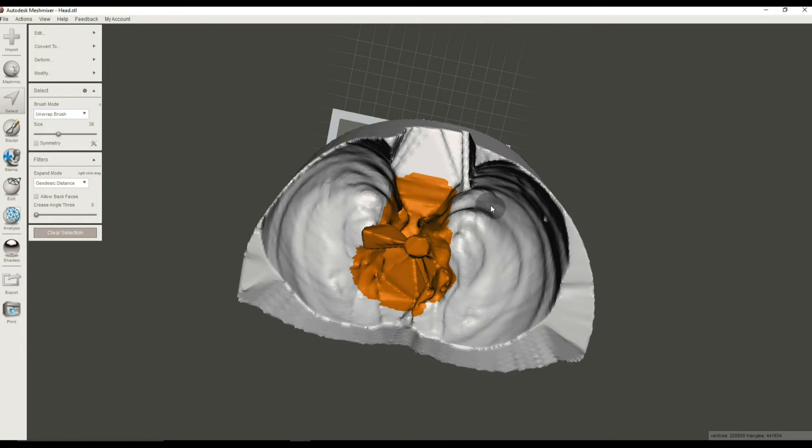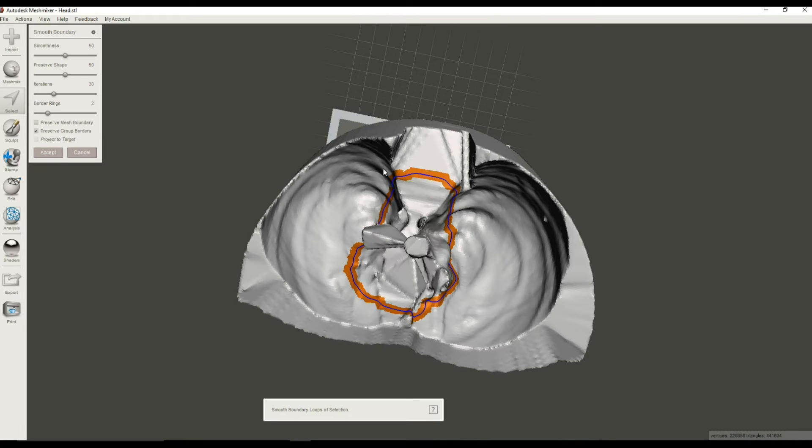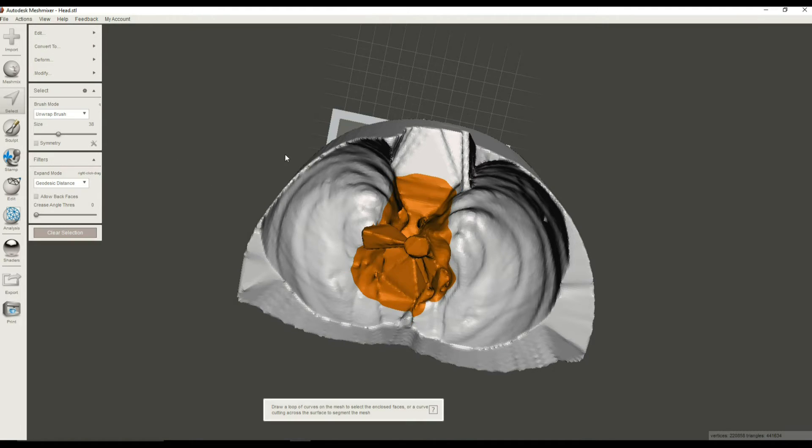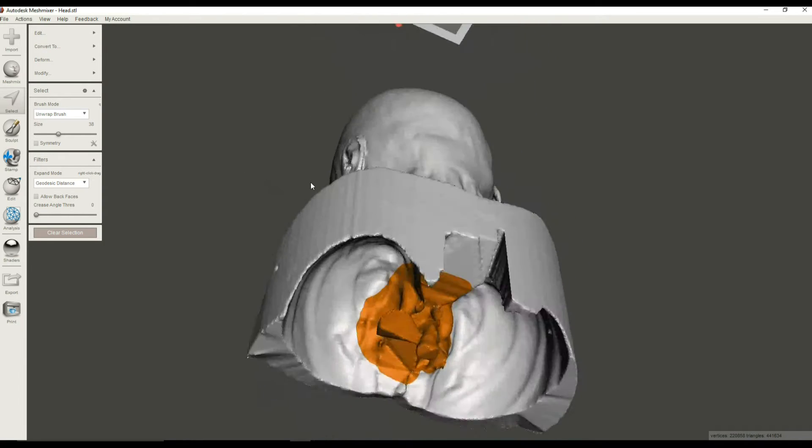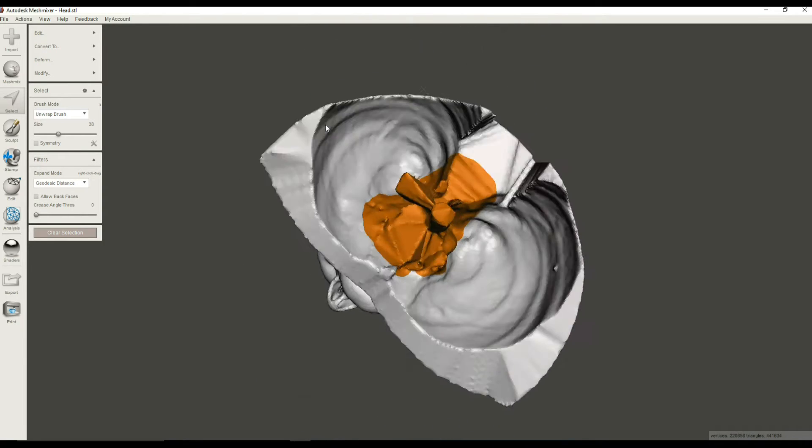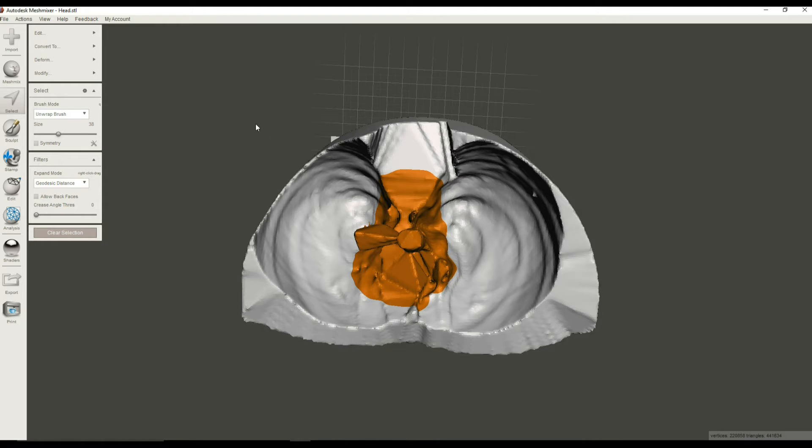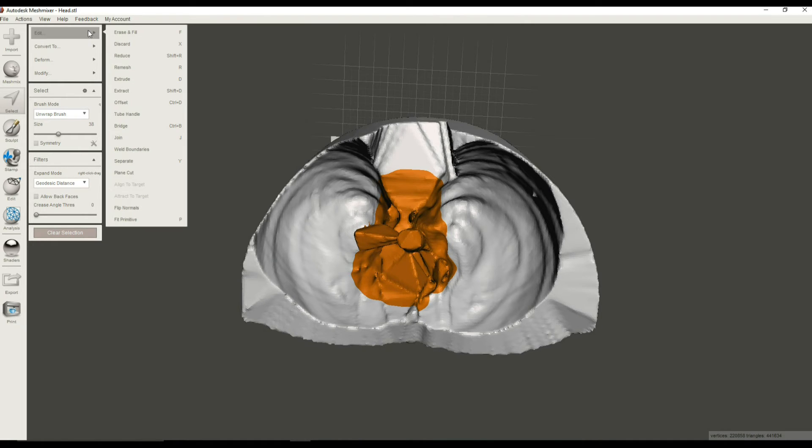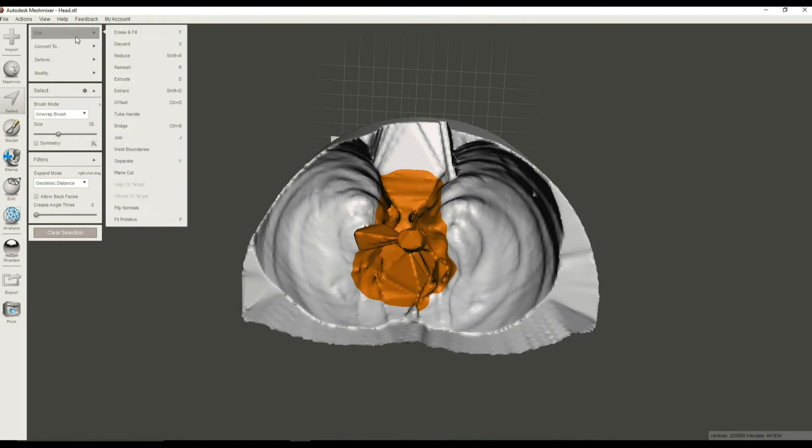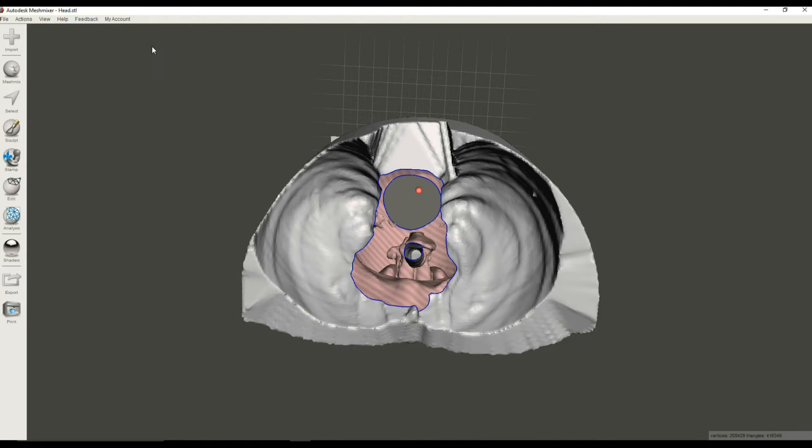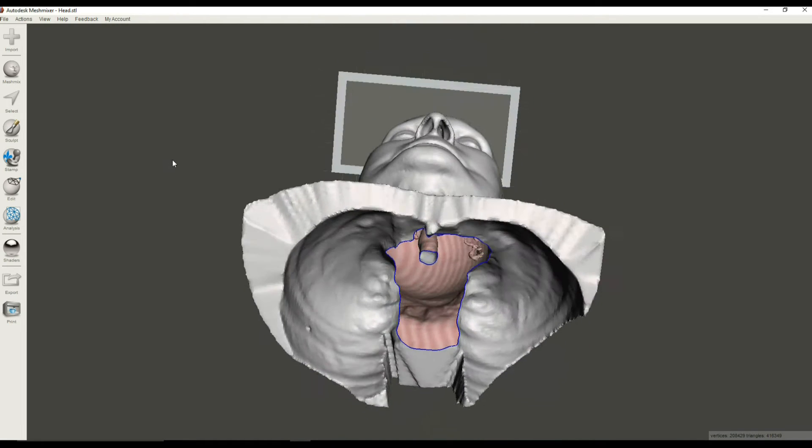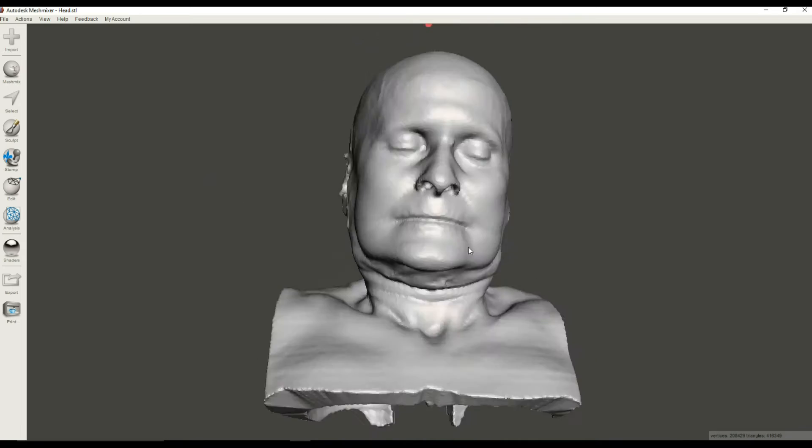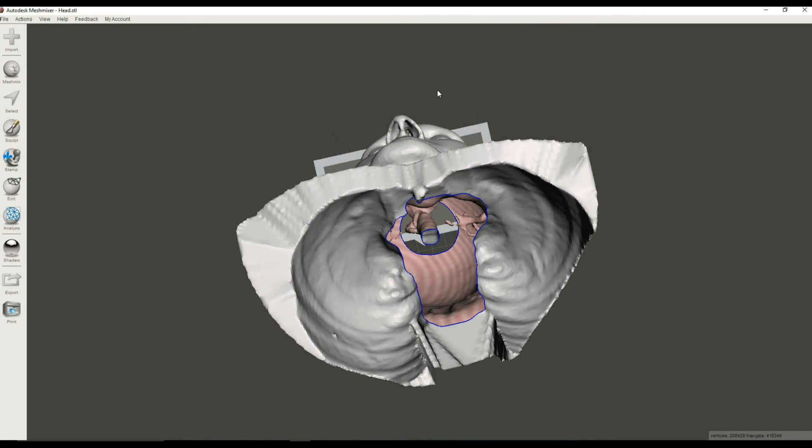So that's, I should say, that's going to be our hole. Now we're going to make this pretty by using Smooth Boundary again. That looks pretty good. I'm going to accept that. So now all of the orange stuff is what we've selected, and we're going to delete that selection by hitting the X key, or I'm going to, where is it, Edit, Discard. Okay.